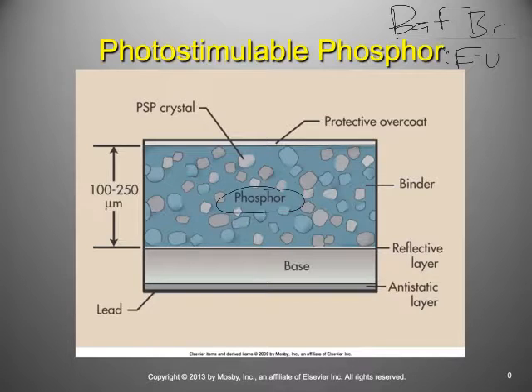The light that's emitted by these crystals, we use the term turbid. The way you can think about turbid is that it's going to scatter. That seems apparent when I look at this picture, because I have this phosphor layer, these crystals here. Imagine these crystals being like the crystals in a diamond ring.